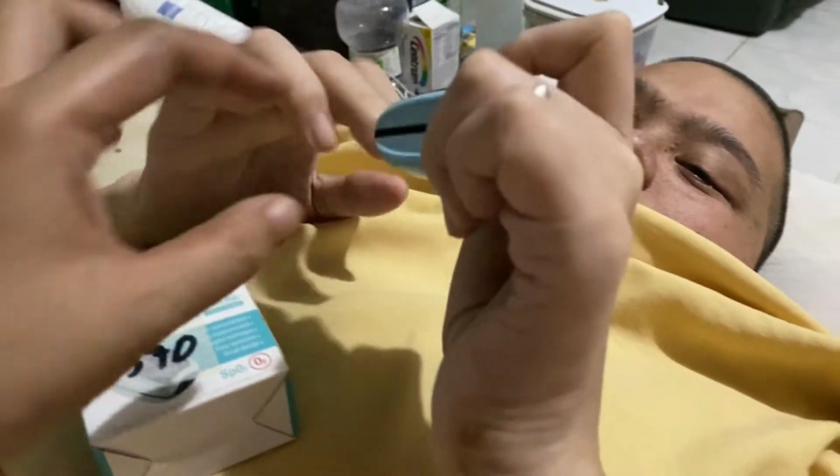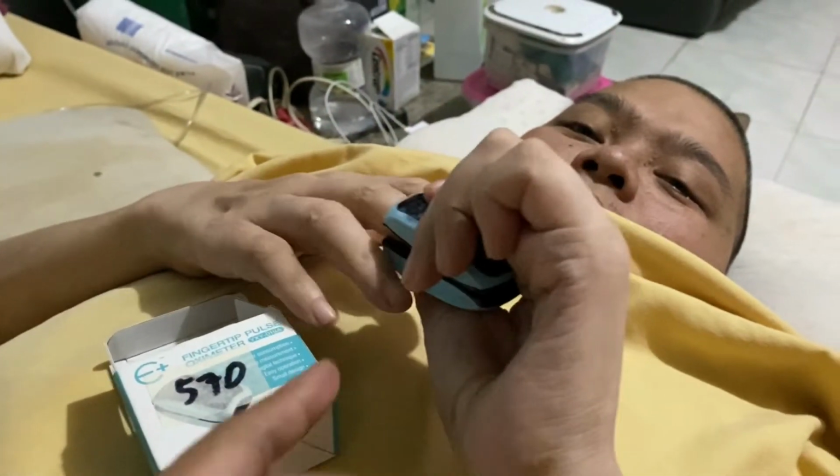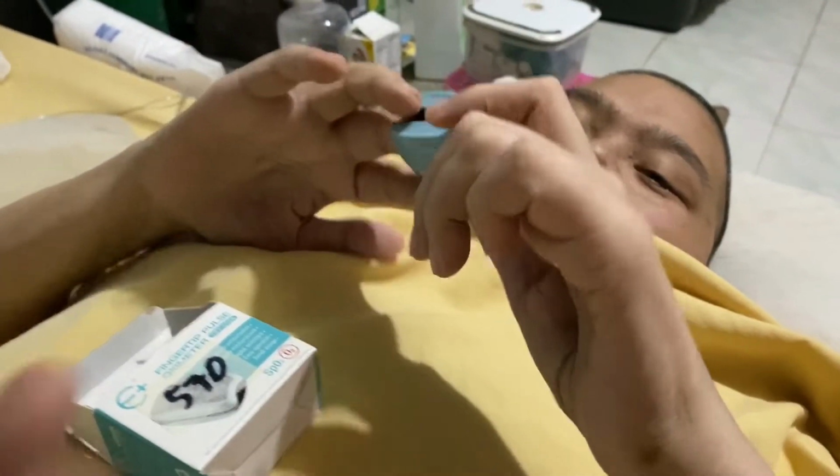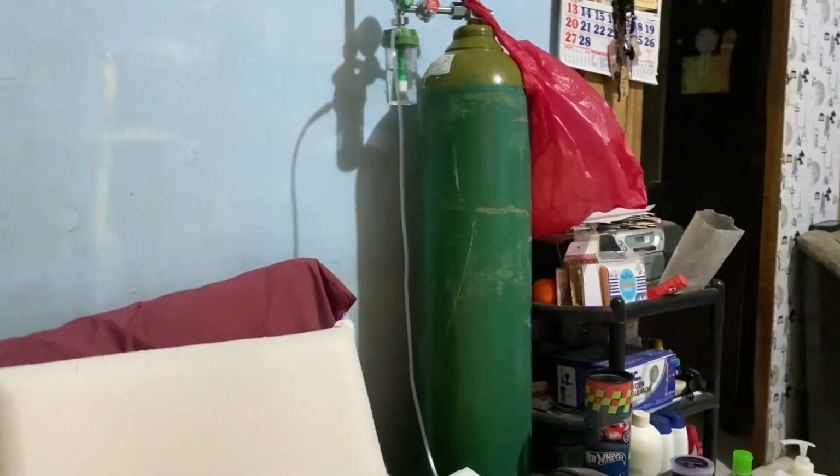So how do we use this? You just put your fingertip and then it reads. If the reading is really low, that's when you will need oxygen.